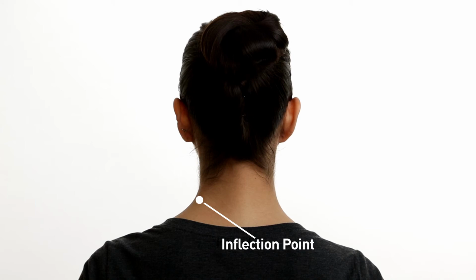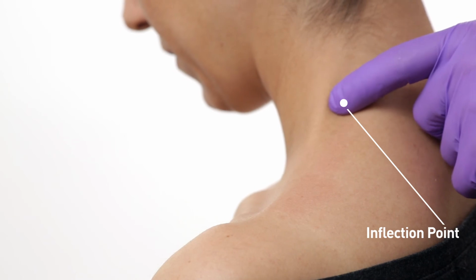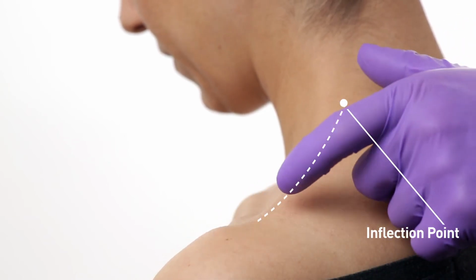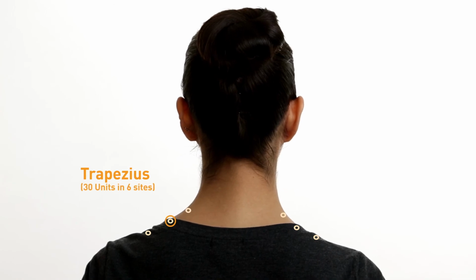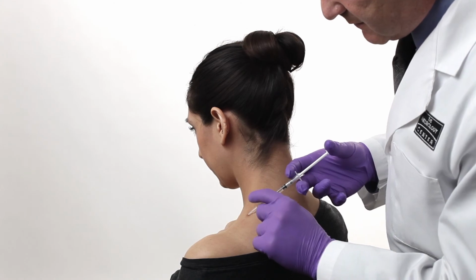The inflection point is where the trapezius muscle swings from a vertical line in the cervical region to a horizontal line in the supraclavicular region. Divide the upper portion of the trapezius muscle from the inflection point of the neck to the acromion in half. The first injection should be administered at the midpoint. Stabilize the hub of the needle and inject.